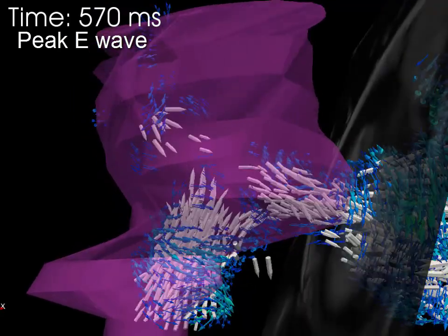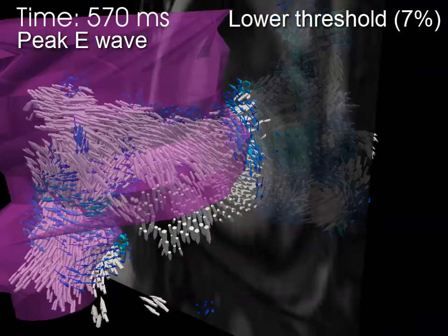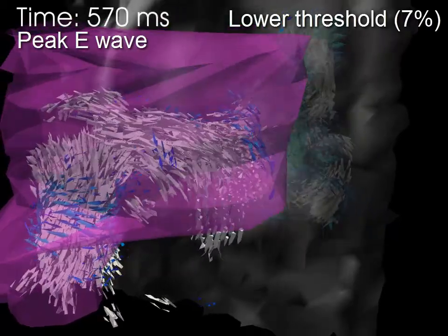Next, we lower the threshold for velocity so that smaller velocity vectors can be seen.